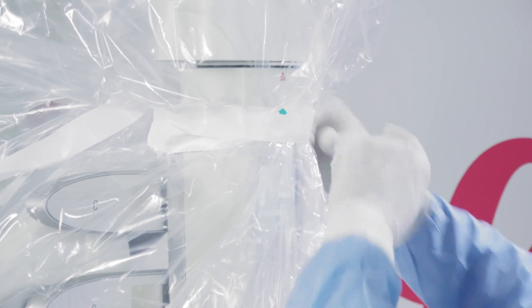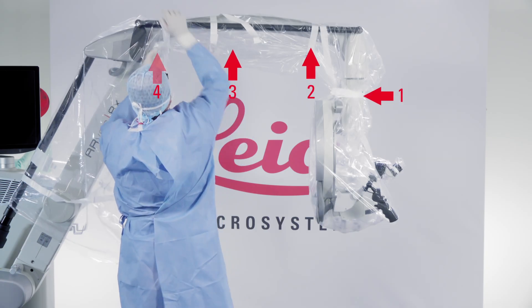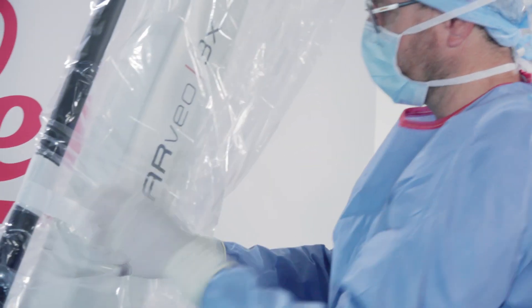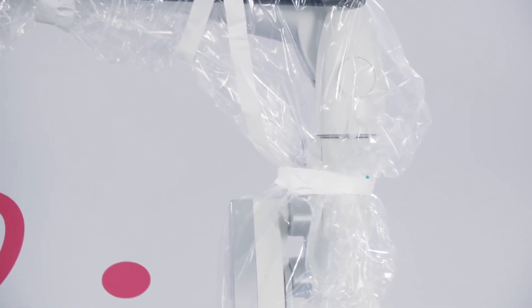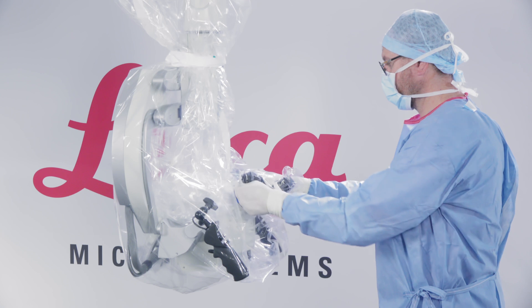Check that the straps are attached around the microscope head and arm, as shown in the images. Choose the option that best suits your practice and type of drape. If necessary, the rubber straps can be used to keep the drape tighter to the main surgeon and assistant binocular tubes, as well as the handles.